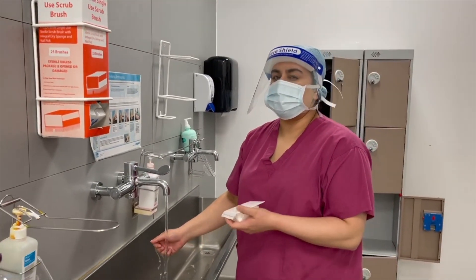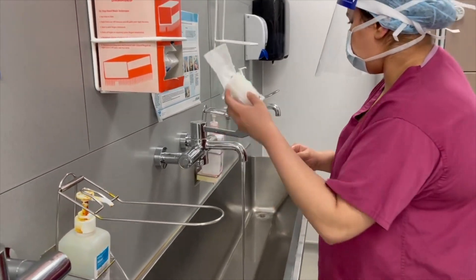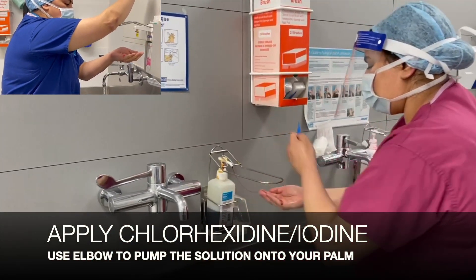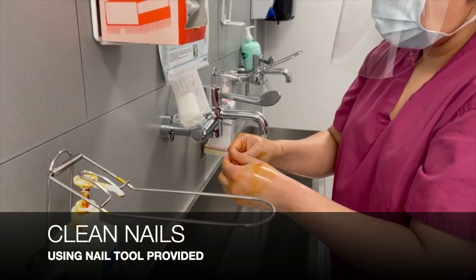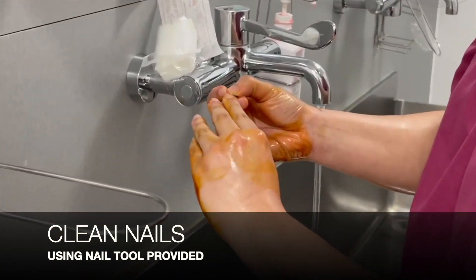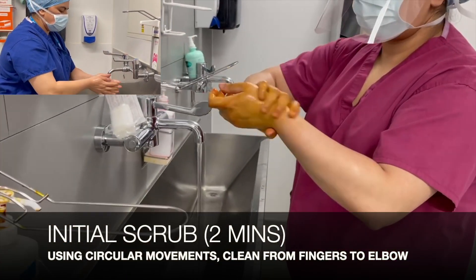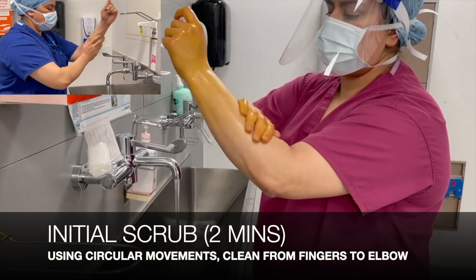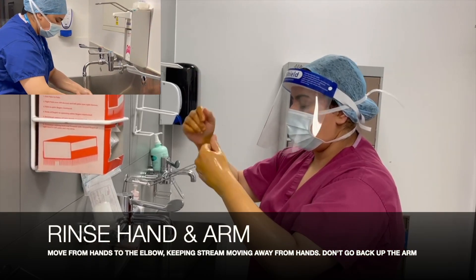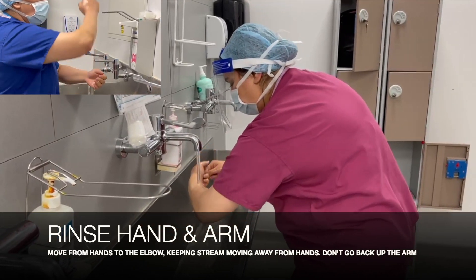We're going to wet our hands and open the scrub tool kit, taking out the nail tool. Using our elbow, we're going to apply iodine onto our palm. Now we're going to clean under the nails using the nail tool. Using circular movements, we'll do an initial scrubbing, cleaning from the fingers to the elbows. We then rinse the hand and arm, making sure to start from the fingers, moving down to the elbow and not going back up the arm.